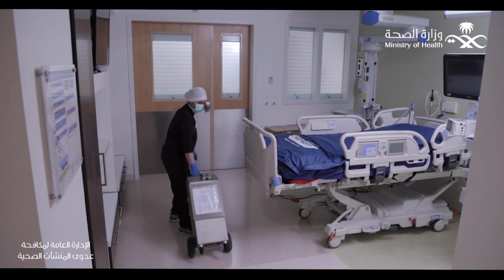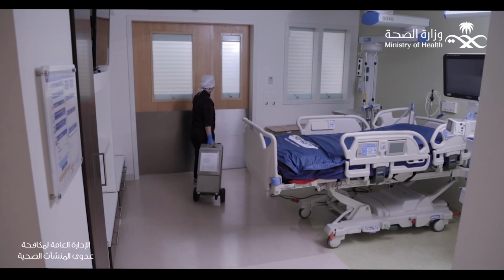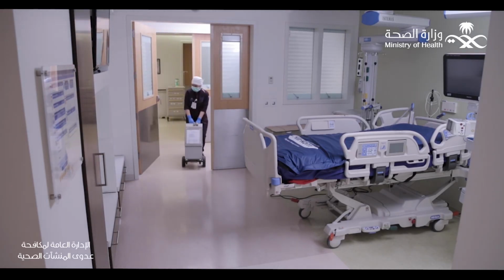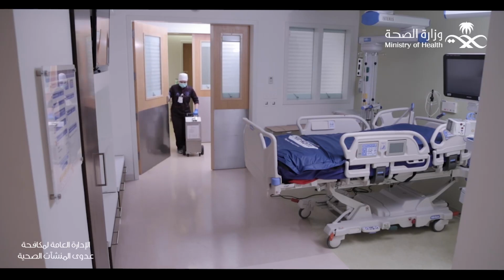After the disinfection process is completed, the health worker enters the room directly and pulls the equipment out, announcing that the room is sanitized and ready for immediate use.